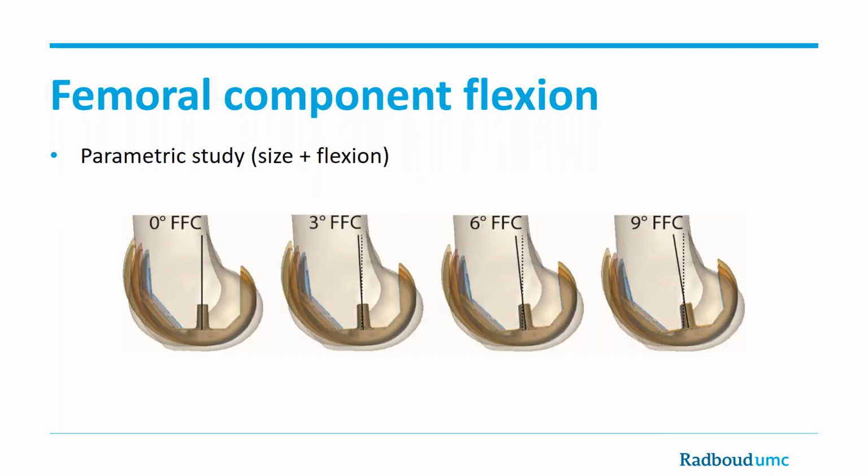So also in this case, we performed a parametric study. We performed a variation of the flexion of the component from 0 to 9 degrees. And we also looked at the combination of the flexion with the size of the implant to possibly understand the interdependence between these two parameters.